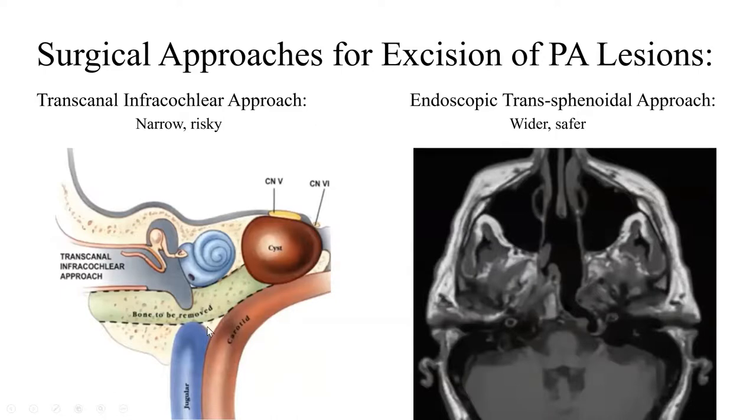There are obvious risks to the adjacent structures, but also the risk of having a very narrow drainage pathway postoperatively, which is then prone to recurrence of the pathology. And in contrast, here's a postoperative picture of an endoscopic transsphenoidal approach, which leaves a wide drainage pathway, which, if performed in experienced hands, is quite safe.